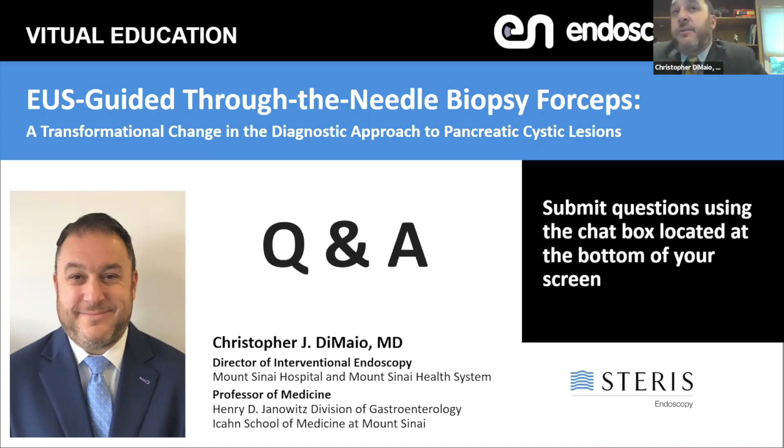The other major application of this, and I showed you a couple of examples, is in young patients. The cysts that young patients get are typically simple appearing, but we know that many of them are neuroendocrine tumors or mucinous cystic neoplasms, MCNs, and we know those harbor malignant potential.